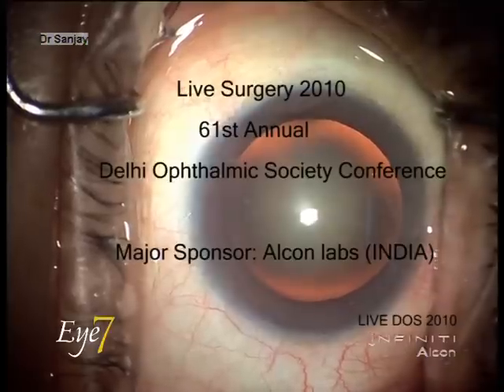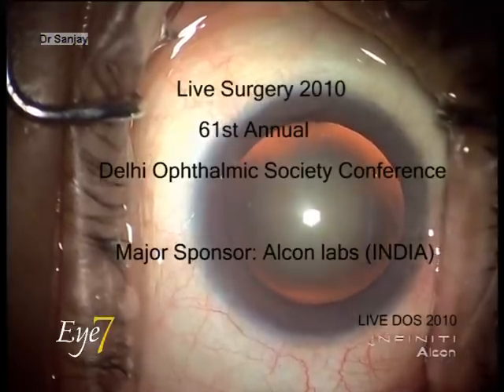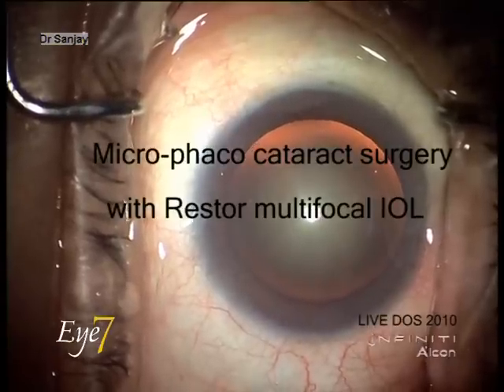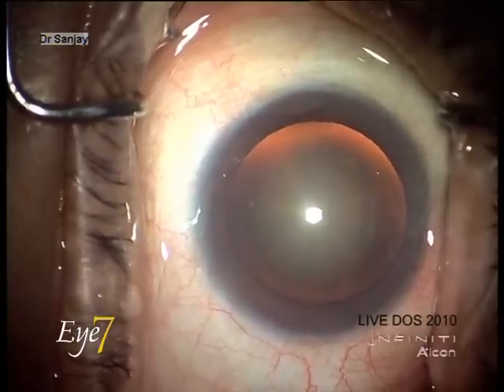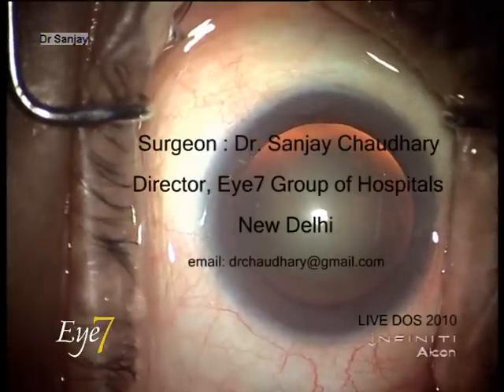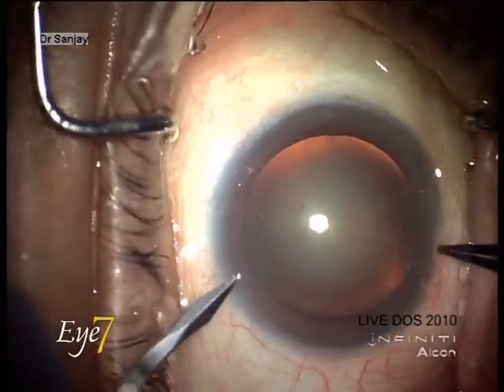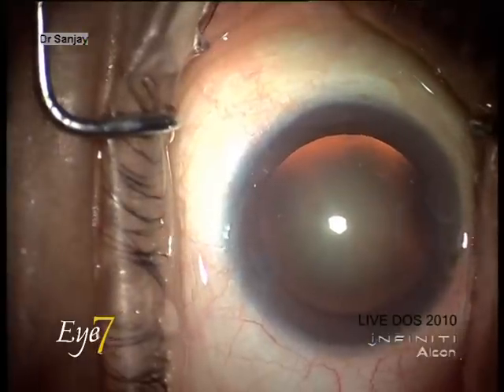The following is a presentation on micro phaco cataract surgery performed at the Delhi Ophthalmic Society Annual Conference 2010. What you would see is a surgery with a ReSTOR multifocal intraocular lens.